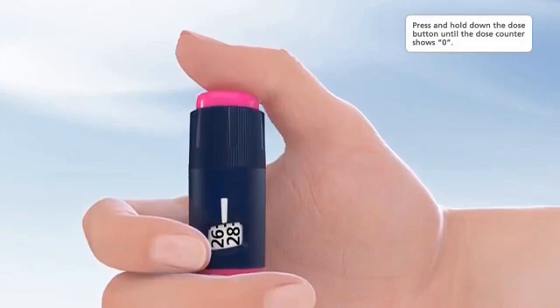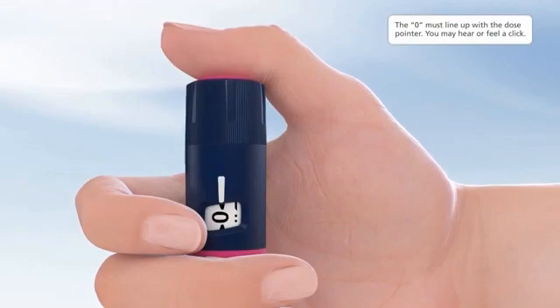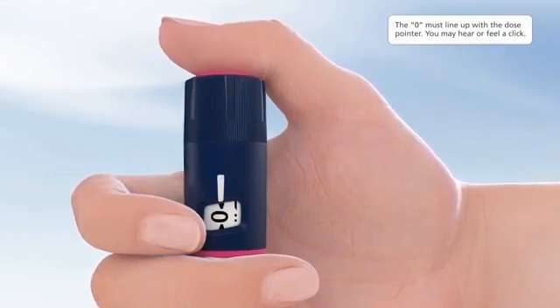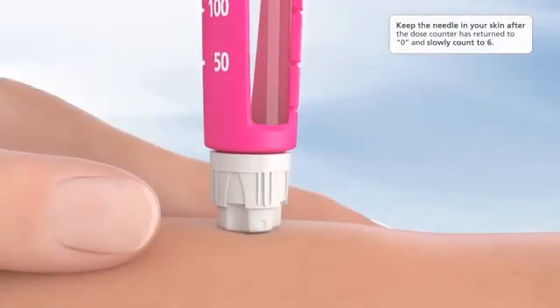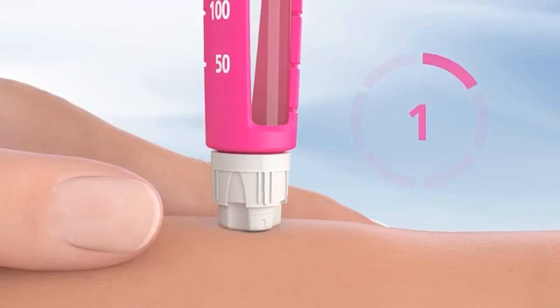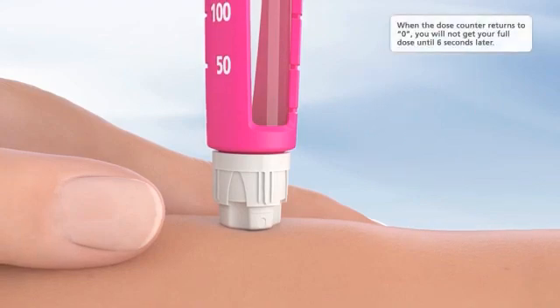Press and hold down the dose button until the dose counter shows zero. The zero must line up with the dose pointer. You may hear or feel a click. Keep the needle in your skin after the dose counter has returned to zero and slowly count to six: one, two, three, four, five, six. When the dose counter returns to zero, you will not get your full dose until six seconds later.